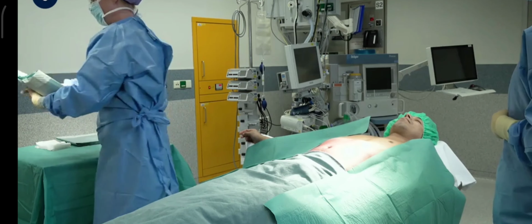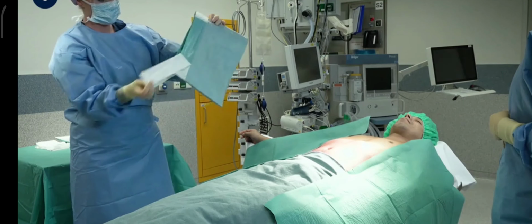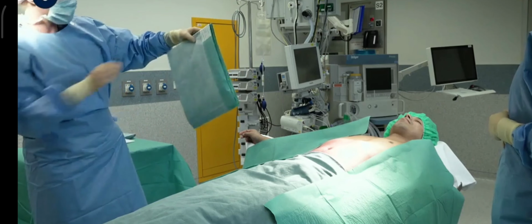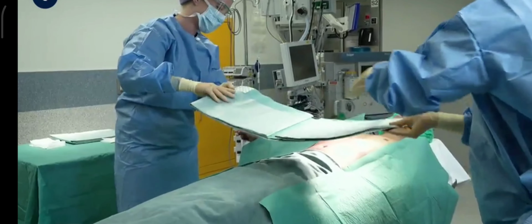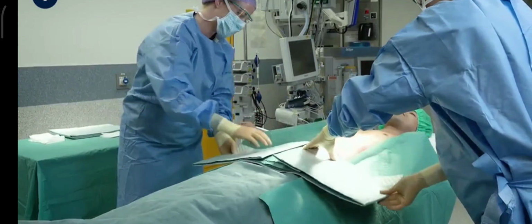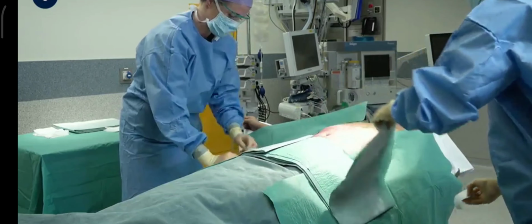The scrub nurse and surgeon now work together to unfold a larger drape. Their coordinated actions are intended to minimize the risk of contamination. In contrast to the smaller drape, this larger drape is first applied. The additional adhesive strip covers are removed, sticking it to the smaller drapes underneath.